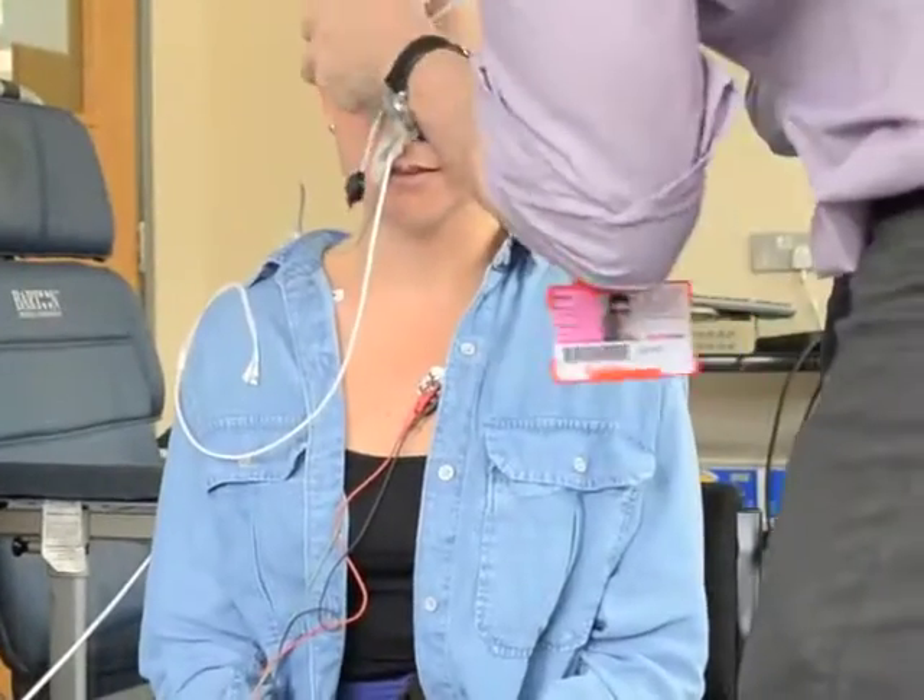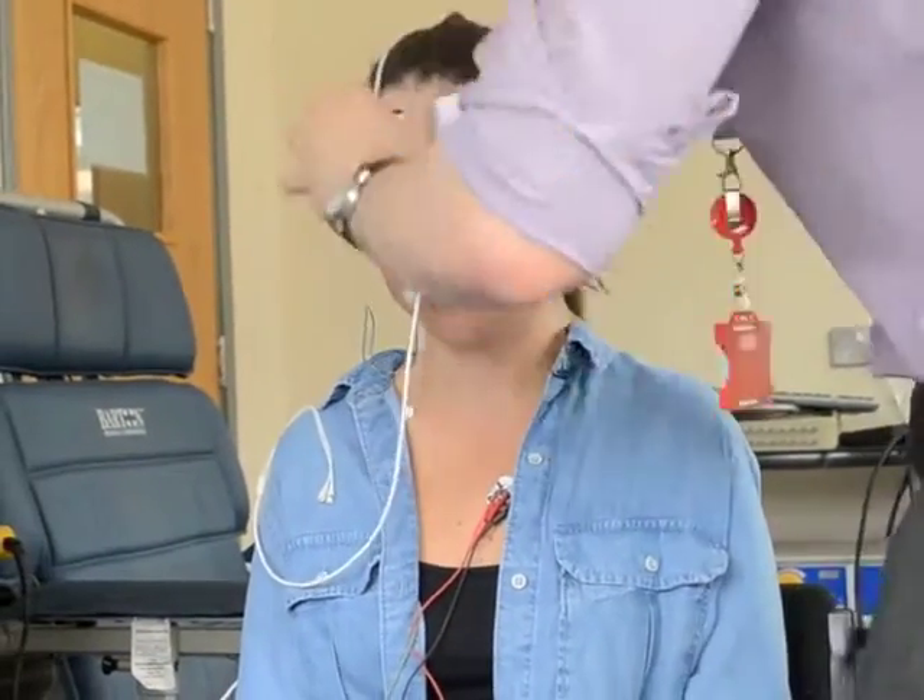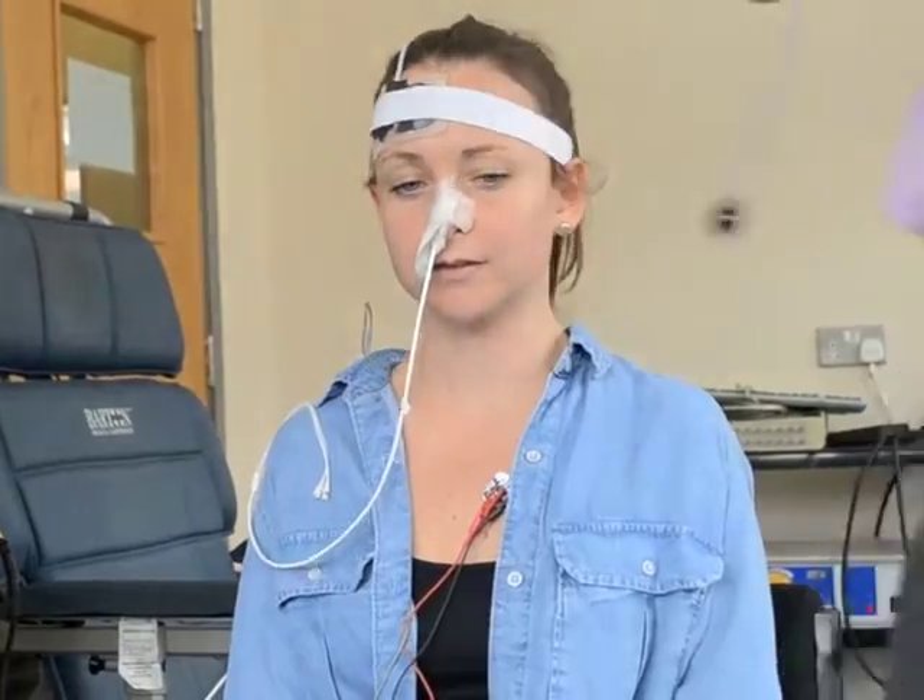This sticker measures the blood flow in the muscles beneath — right now this is the prefrontal cortex of the brain.